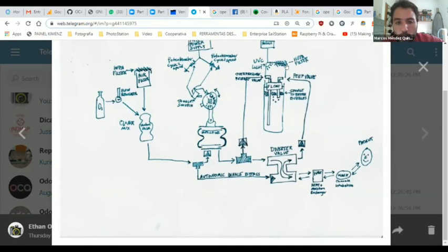The machine is totally hardware agnostic, so you can use any motor, any bellows system, any kind of filtering or valve or O2 setup. And that's the good thing about the system.